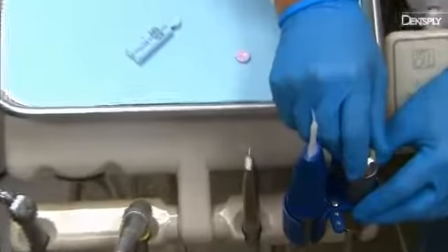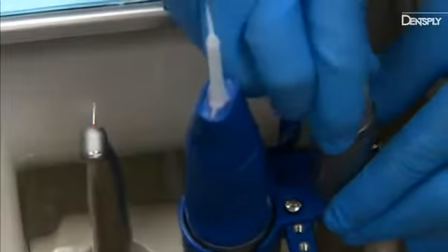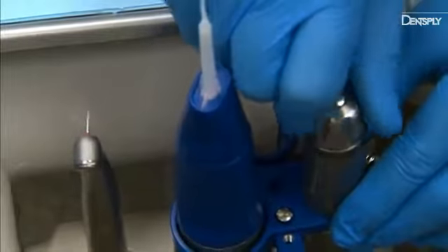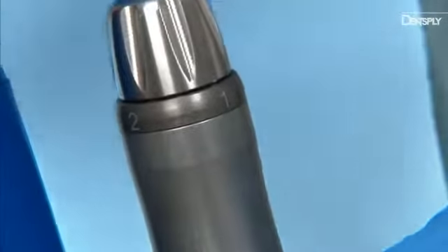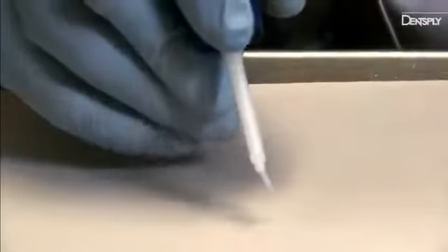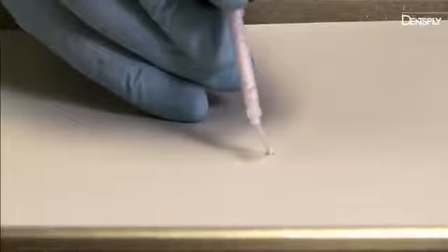Aquasil Ultimate has four settings to control flow, with one being the lowest and four being the highest. Turn the knob to increase or decrease the flow. It's best to start with the regulator on setting one and increase the pressure as you get familiar with the technique. Test the device before use. Once you've set the desired flow, you're ready for your patient.